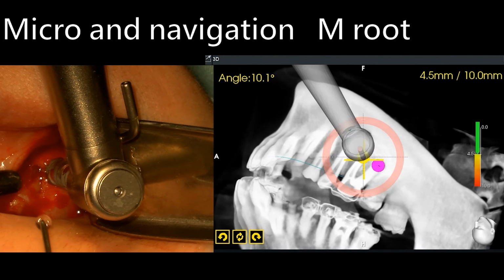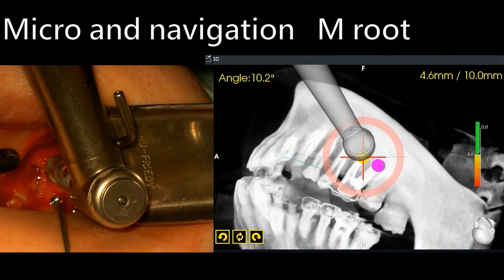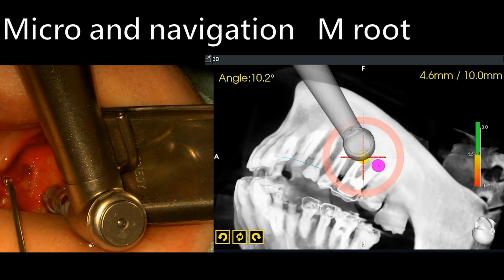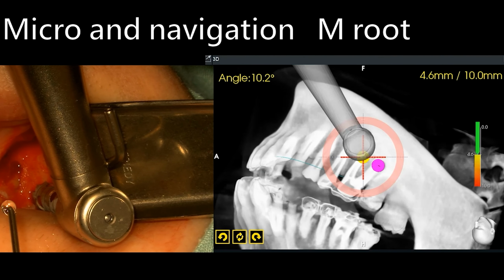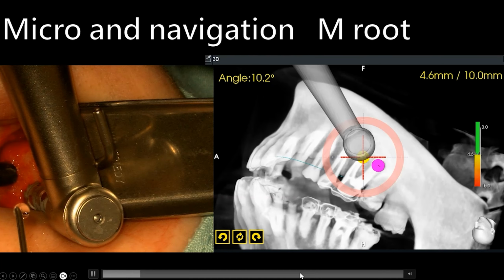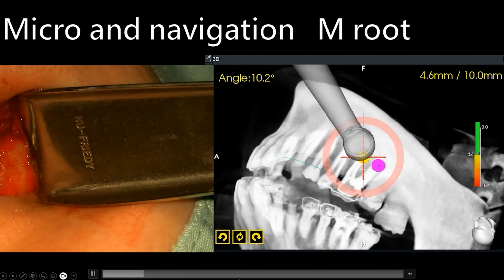This is the synchronization of the microscope image and the navigation system. With the Taiwan company's system, you can see there will be some computer lag here.